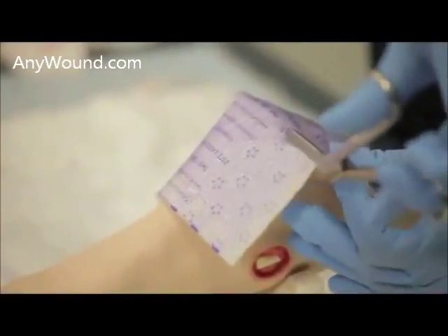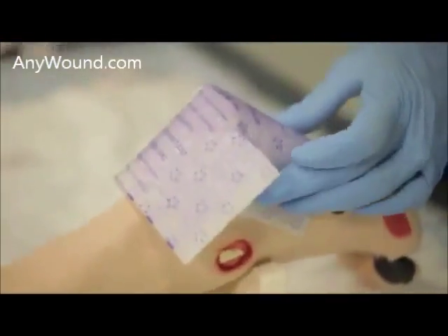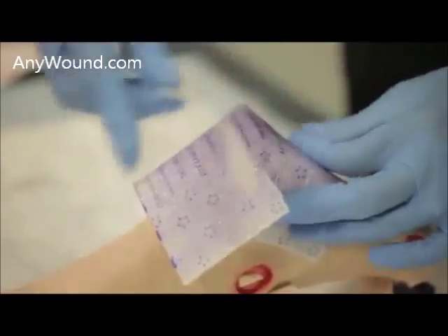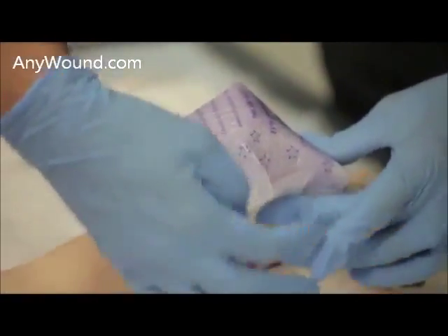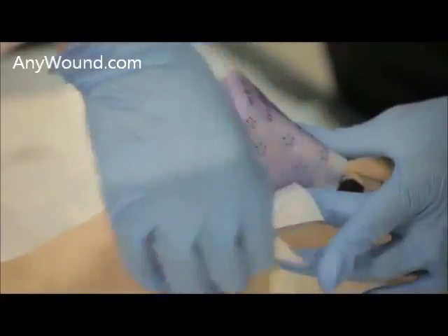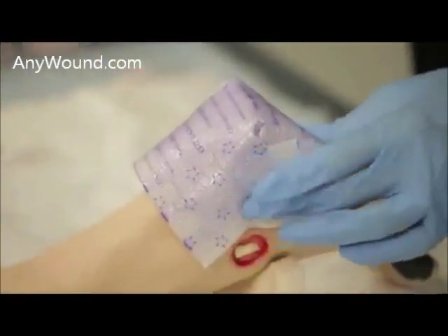You will also do the same thing on this side — folding this down, securing to the patient, and then securing the other side down as well.